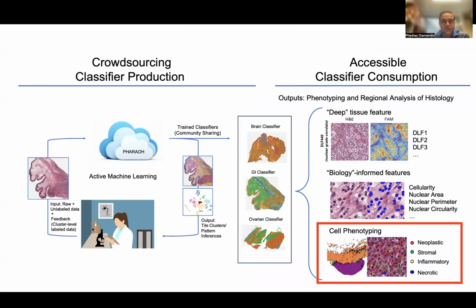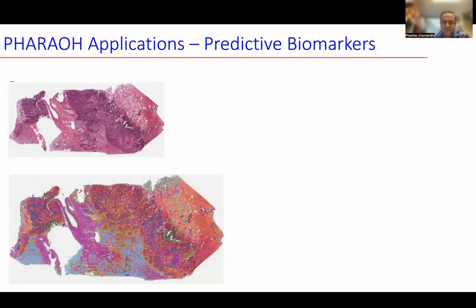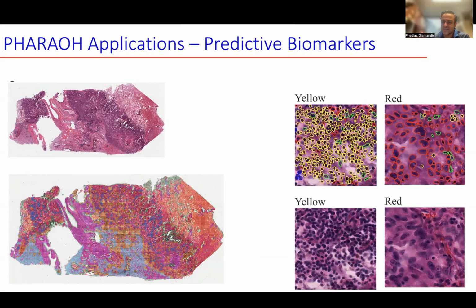And lastly, in addition to just looking at tumor cells, you can also look for differences in non-neoplastic cells, such as inflammation and stroma. So we developed this workflow where we use HoverNet to profile the different cell types within these individual tiles. So here's a HAVOC map of this lung cancer, and you can see that the cancer is this dark staining area here in the red, and then at the perimeter there's this yellow pattern that the computer proposed that infiltrates into the tumor area. These other areas are lung tissue and some larger vessels or luminal structures.